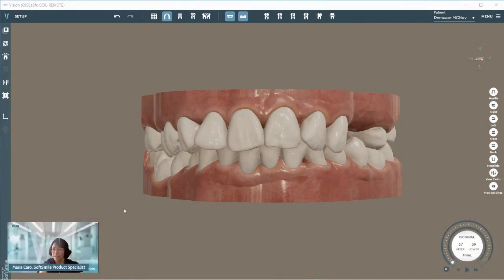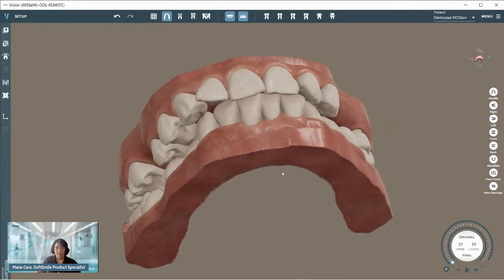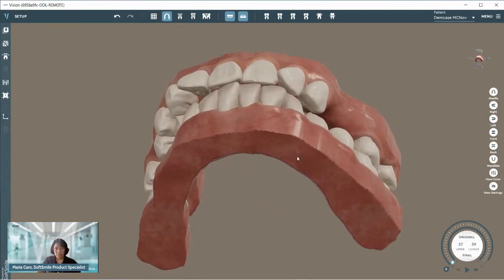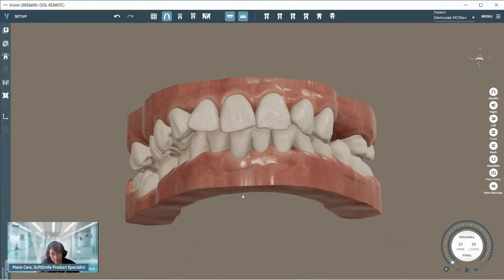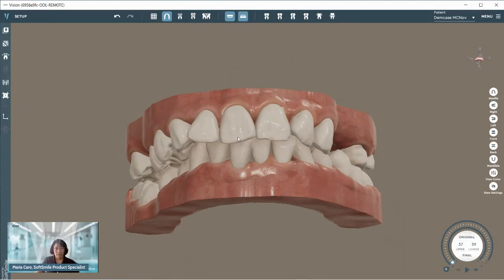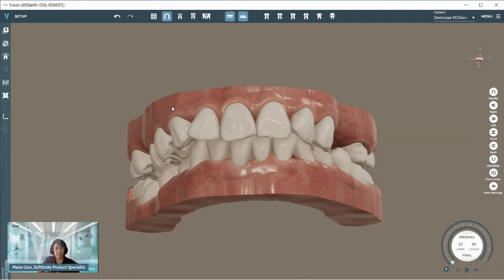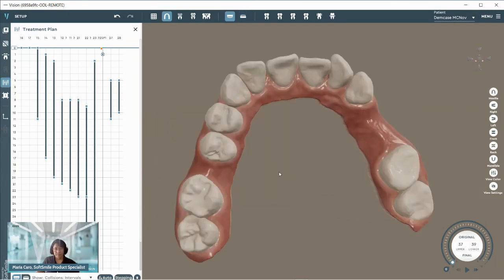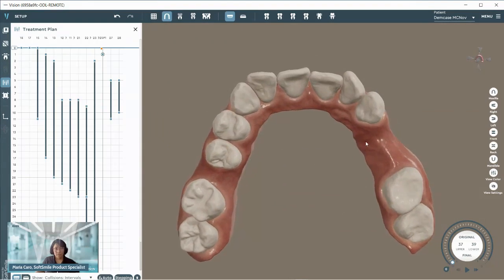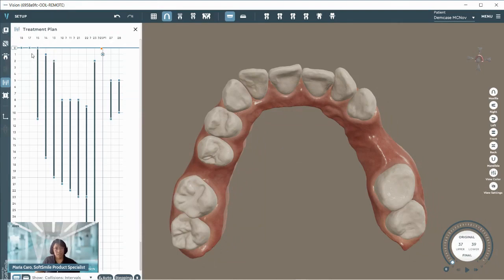At this point you can probably already see our case on your screen. We have a case with some upper and lower anterior crowding, a deep bite, and a unilateral crossbite. We'll focus on how we achieved creating a complete treatment plan and not so much on what was moved. I'm going to open up our treatment plan and focus on the upper arch first. As you can see, we're at the malocclusion, and on the left side of your screen you'll see the staging table, which we call it that because we have full control of everything that happens inside that table.